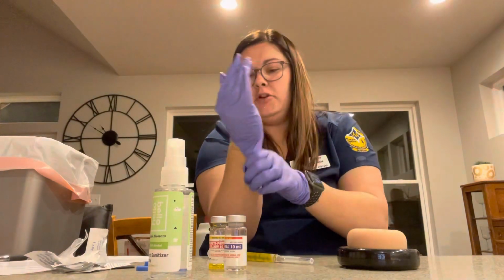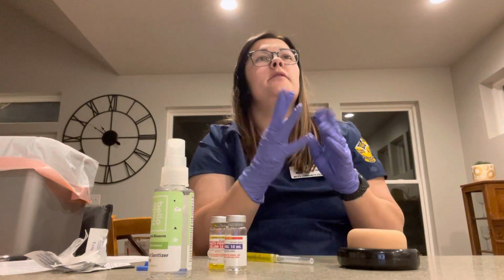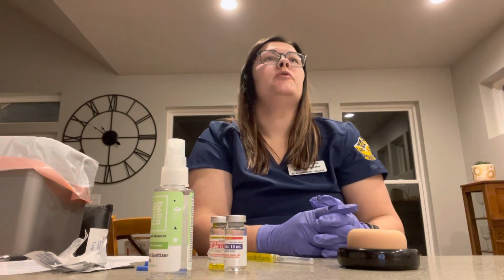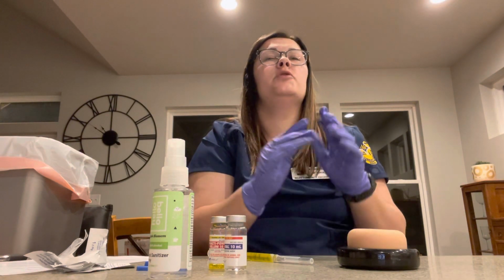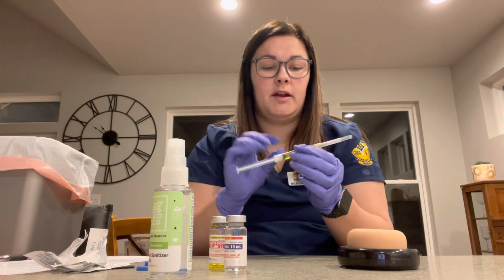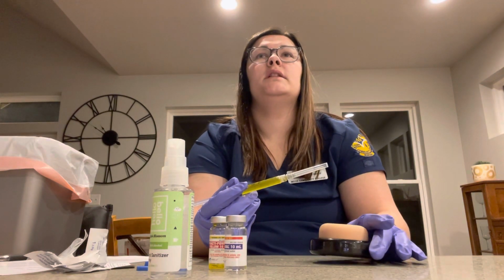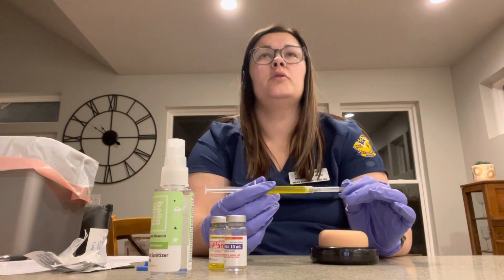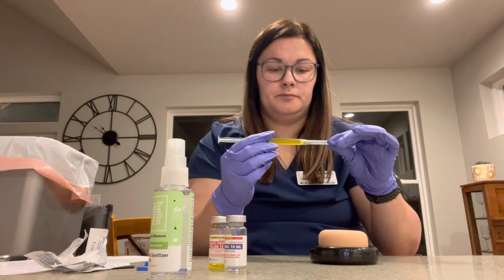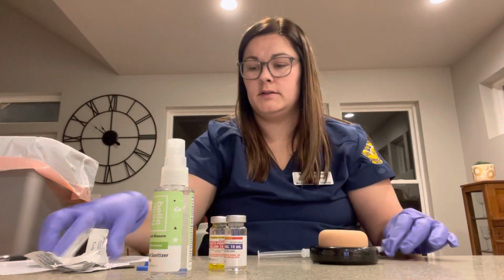Skip, I'm going to be giving you a reconstitution of Rocephin, which will help fight that bacterial infection. I can either give it to you in your outer thigh or your lower hip. Which area would you prefer? Lower hip. Okay. I will be using the Z-track method today. With your lower hip, you can either be standing or laying down. Which one would you prefer? Standing. Okay. Do you have any questions for me before I get started? No. All right.